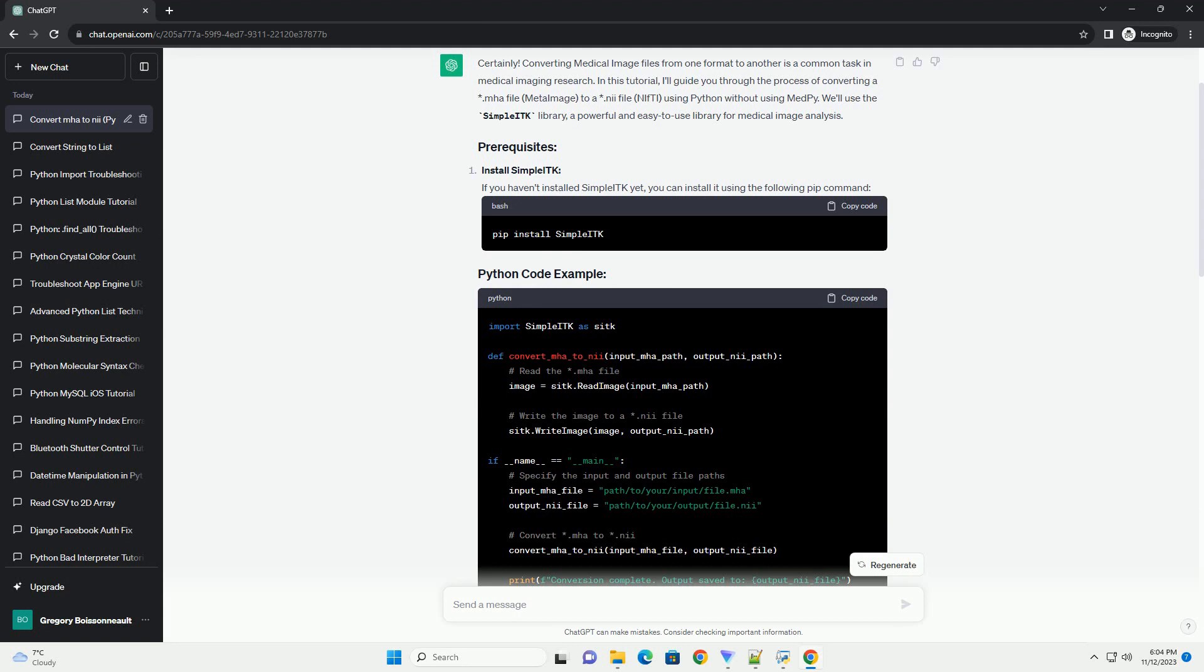If you prefer working with C++, you can use the ITK (Insight Segmentation and Registration Toolkit) library, which SimpleITK is built on.